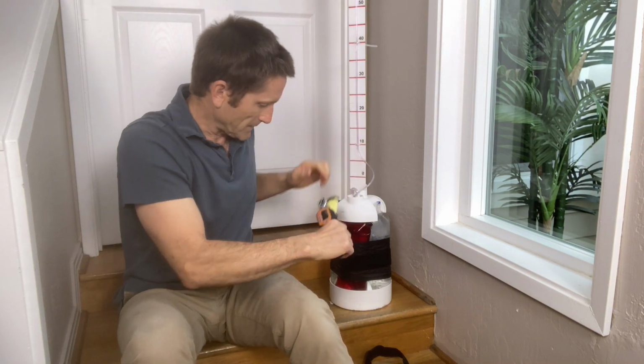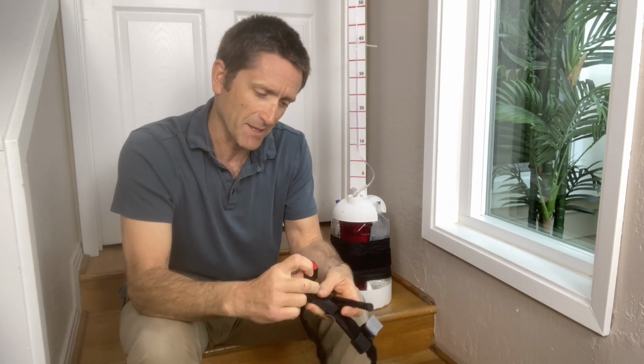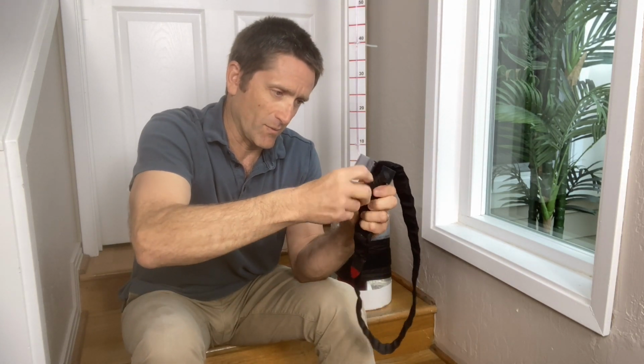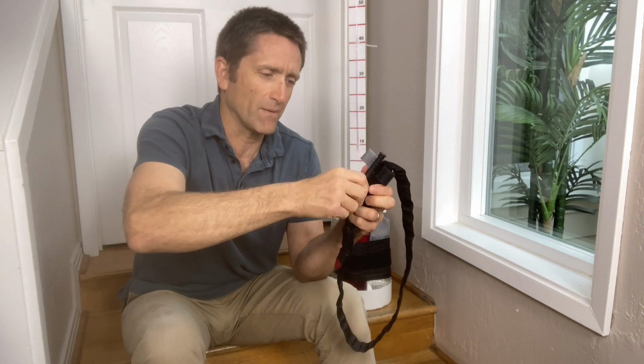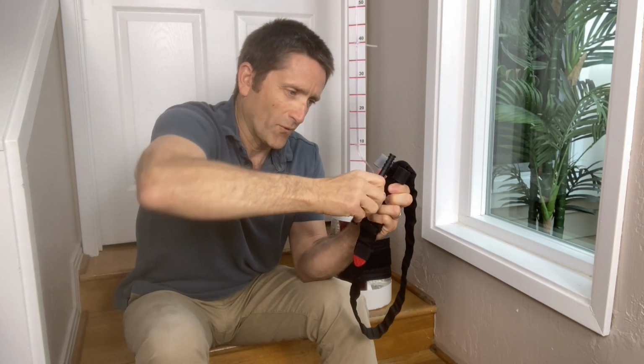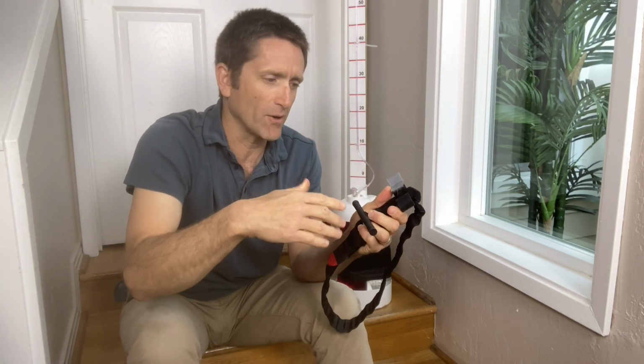All right. So next step is talking briefly about tourniquets and going into something I talked about before, which was tourniquet runway. So how many twists can you get from a specific tourniquet? This is the CAT. Right now there's no leg in there, and this is as big as possible. So 1, 2, 3, 4, 5. Right now, that's 6 turns, there's no leg. So the most number of set points, I'd say for the CAT, is 6.